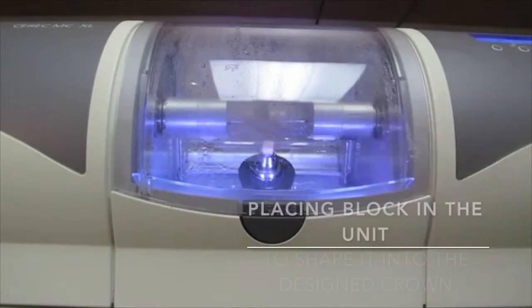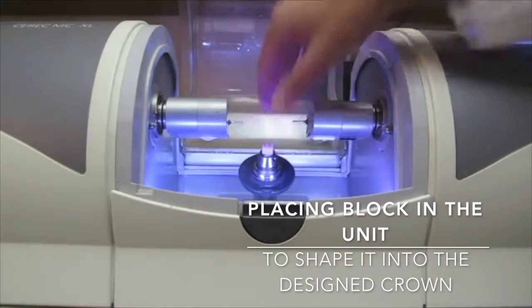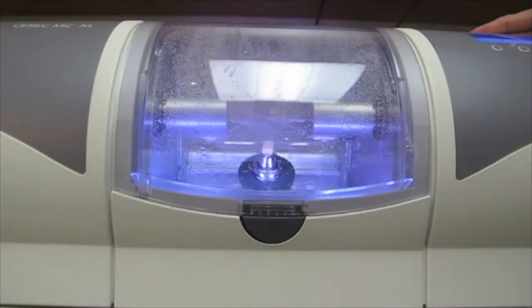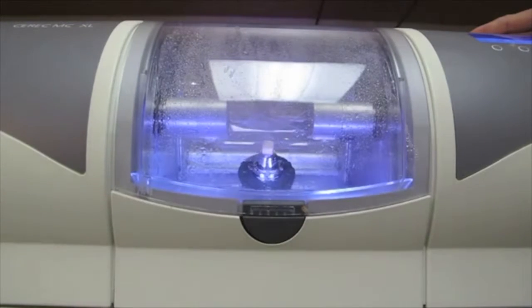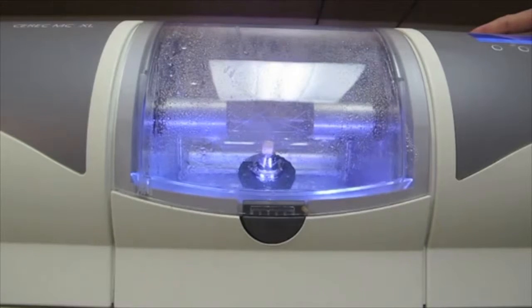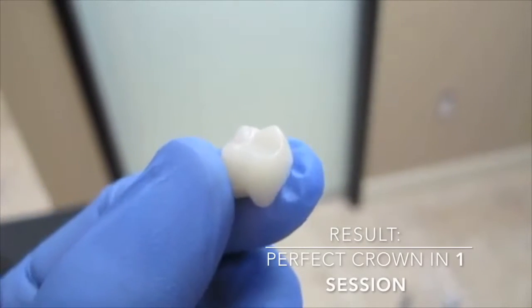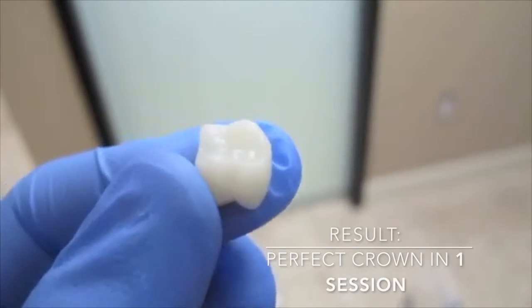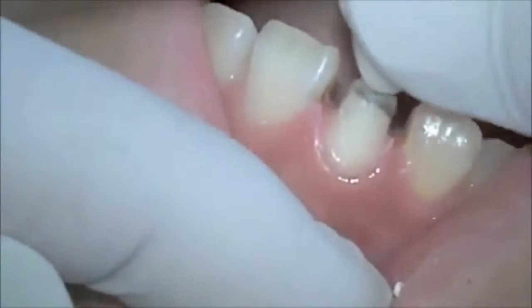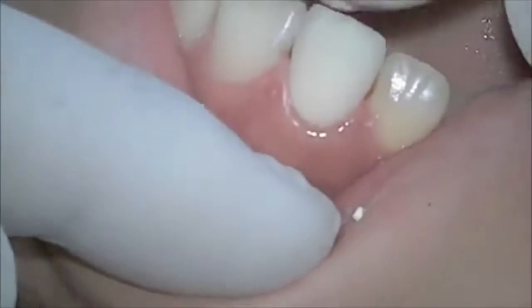Placing the block in the unit to shape it into the designed crown. Perfect, strong crown in one visit with no need for temporaries. And that is a perfect fit.